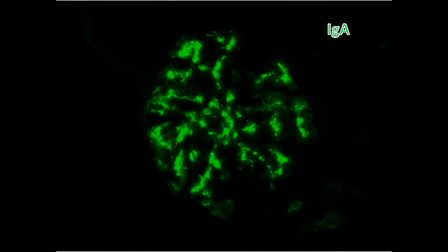وسوينا ال IF and everything was negative except for IgA and lambda. And this is the glomerulus, and actually اللي positive هني, this is an intensity of 4, اللي positive هو الميزانجيوم. Okay, هذه اللوبس, ما عندنا شيء في اللوبس, we don't have anything. So when we talk about where is the staining هني, this is mesangial staining.